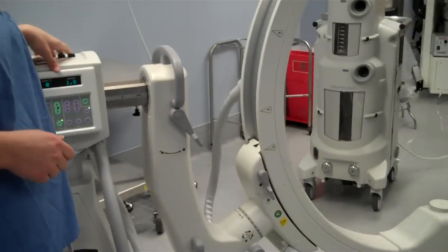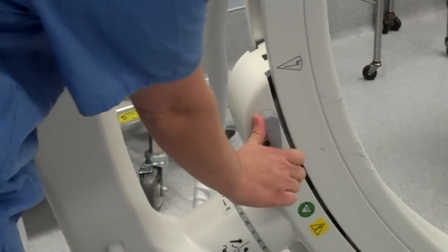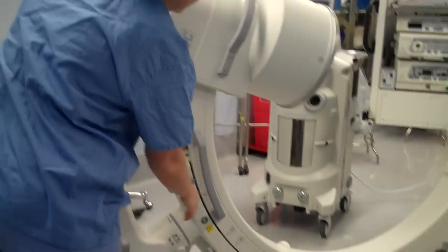The next lock I'm going to be showing you is the lateral lock. It allows you to go from AP to a lateral position and any oblique position in between. The release for this one is right here. You can swing partially or you can swing all the way to a lateral position.